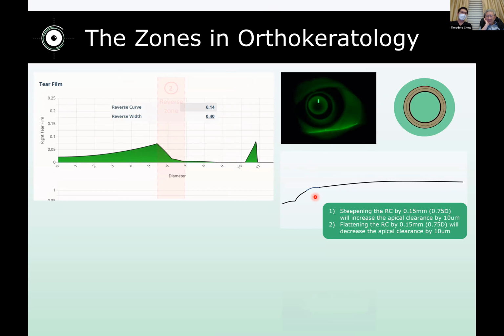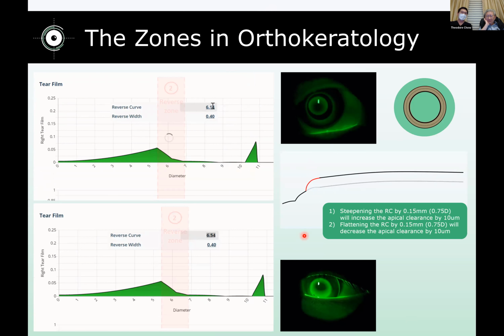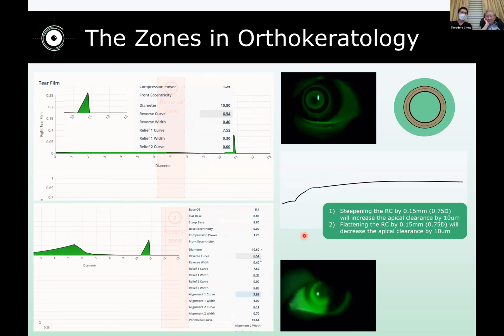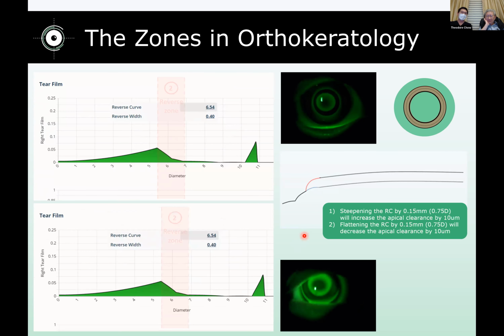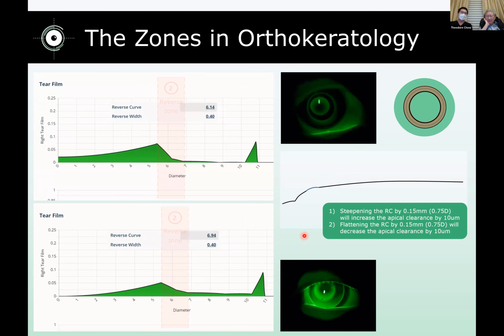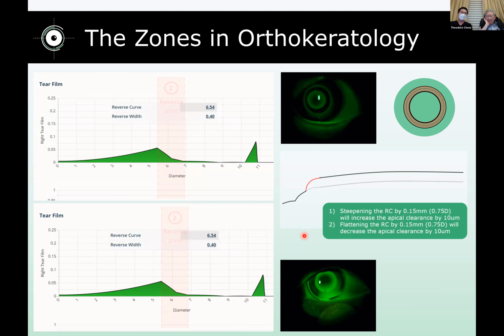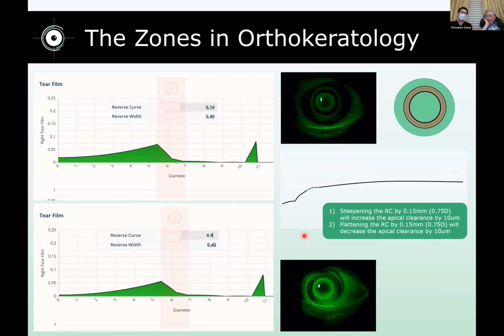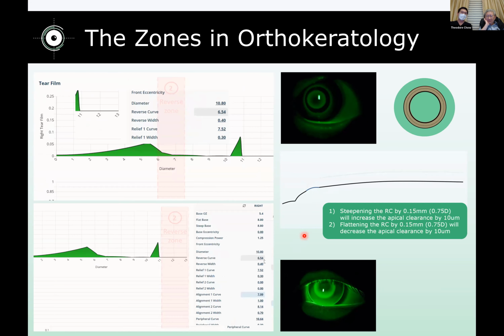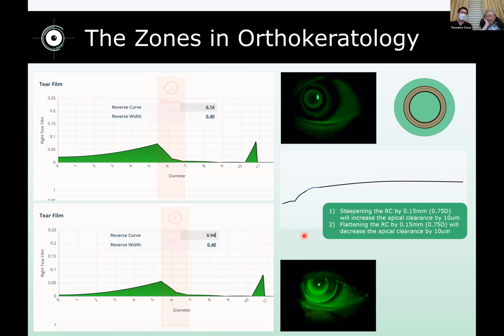And then the opposite is true for that pooling in the alignment curve. Initially, when I was playing with the software, I tried to play with this so that I could teach myself the dynamics of contact lens fitting. As a student learning this, it was very, very helpful just to use the customs platform to understand the lens and cornea dynamics and fitting dynamics.